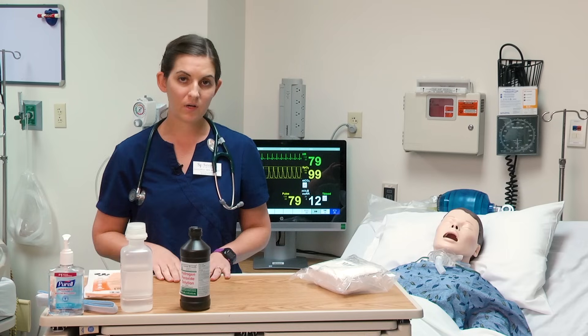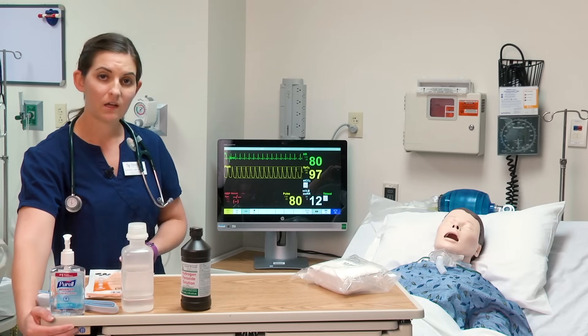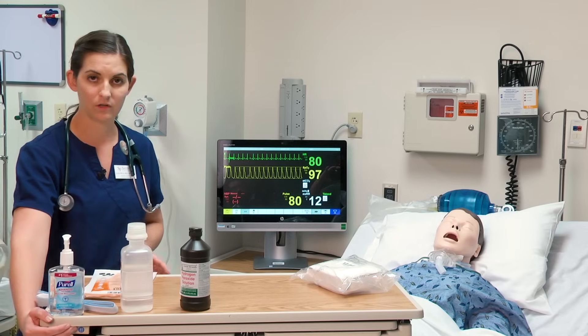I'm going to open up my table to give me a larger working surface. I have already identified the patient, washed my hands, and told the patient what we're going to do.